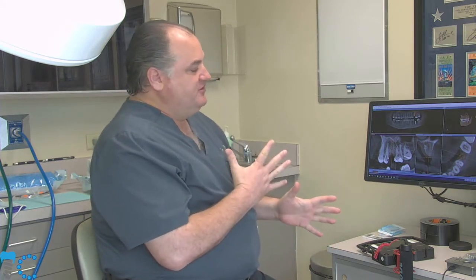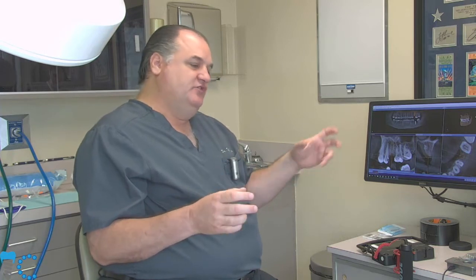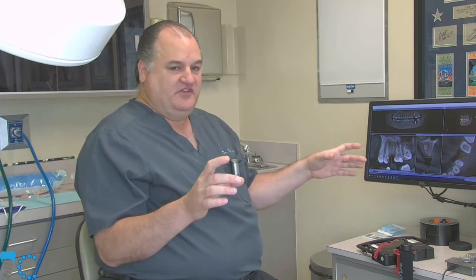So a 10mm tooth width with a 6mm collar means that we have 4 millimeters of overhang. So if we get our implant smack in the center, then we have 2 millimeters of overhang on each side of our implant, which is acceptable. More than 2 millimeters is very undesirable.